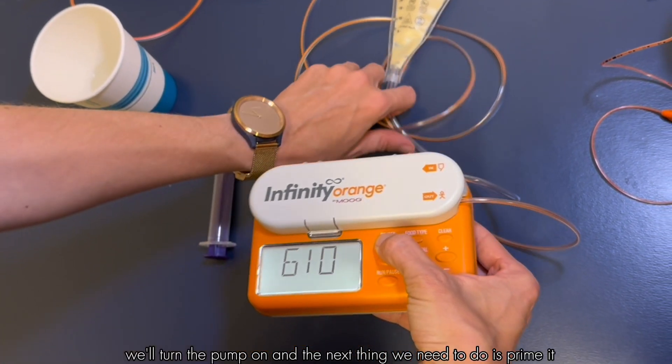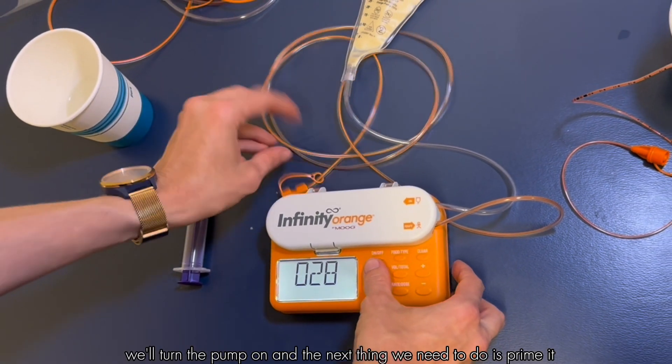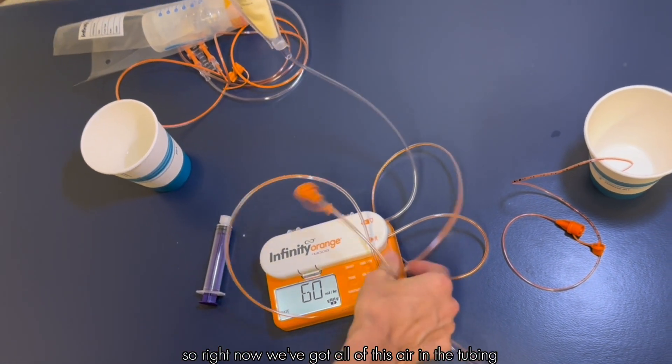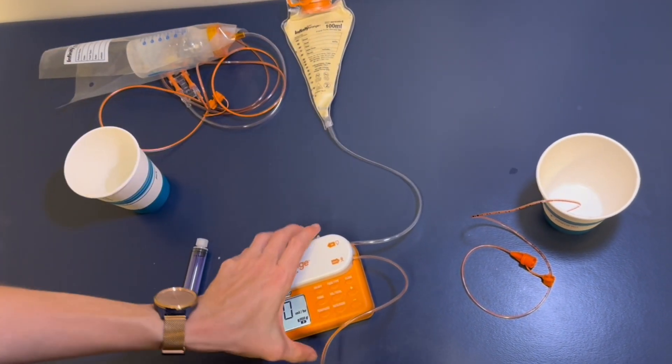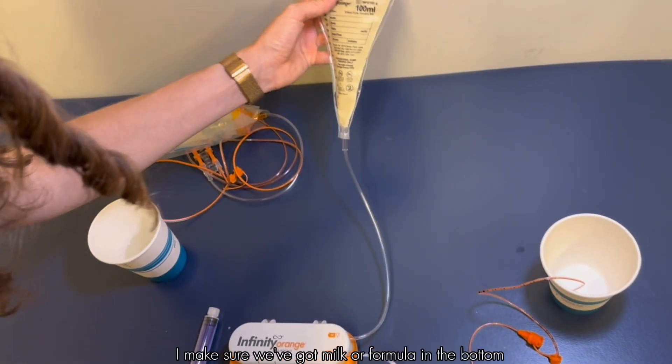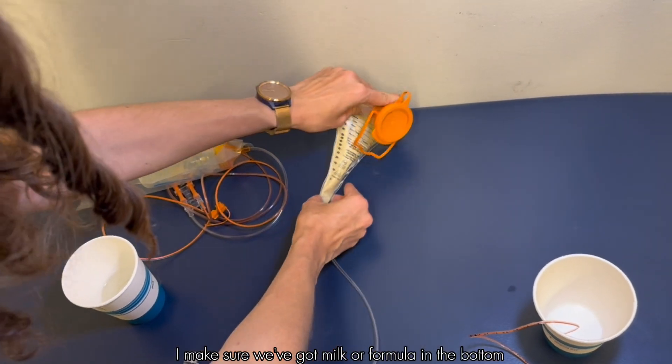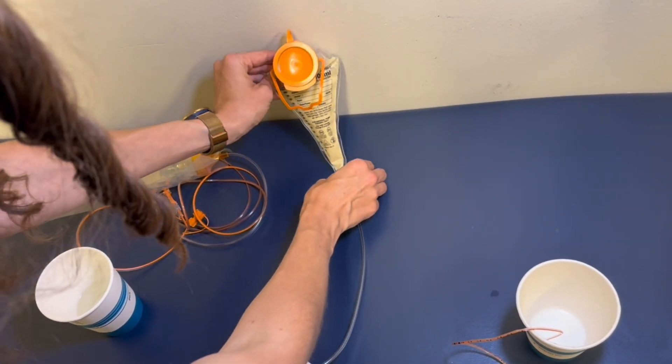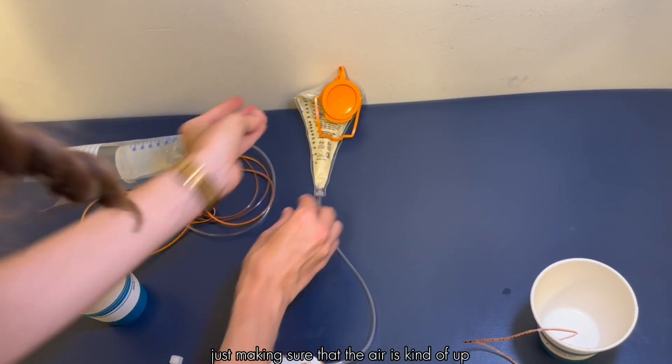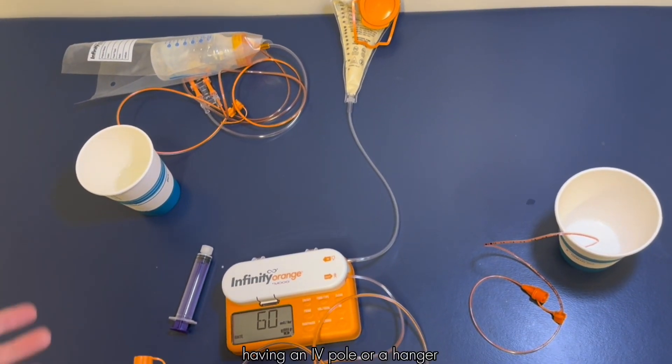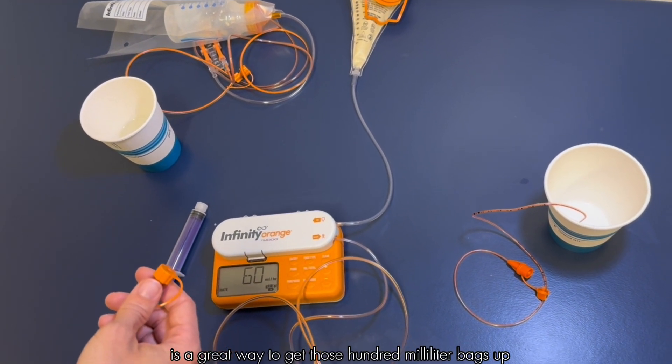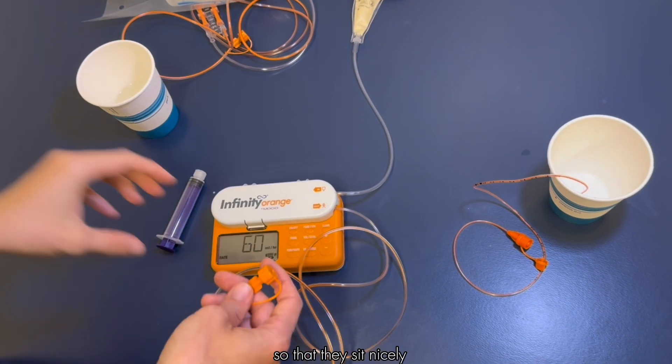We'll turn the pump on and the next thing we need to do is prime it. Right now we've got all of this air in the tubing and we don't want that air going into baby. I'm going to set up my bag to make sure we've got milk or formula in the bottom. Just making sure that the air is kind of up. Having an IV pole or a hanger or a command hook is a great way to get those hundred milliliter bags up so that they sit nicely.